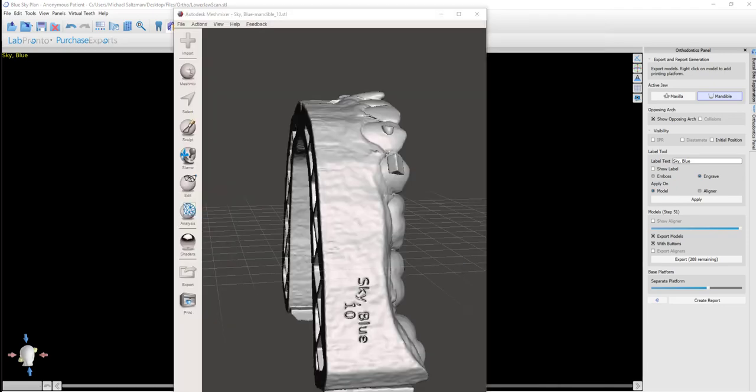The last functionality that I want to point out in the orthodontics panel is the option to create a report. Clicking the Create Report button will automatically export a PDF file where you could save onto your computer that contains information regarding the case and regarding the step-by-step tooth movements at each stage.